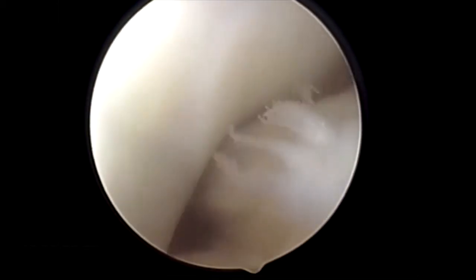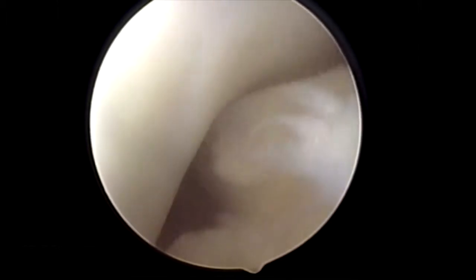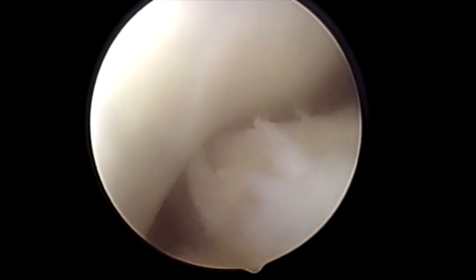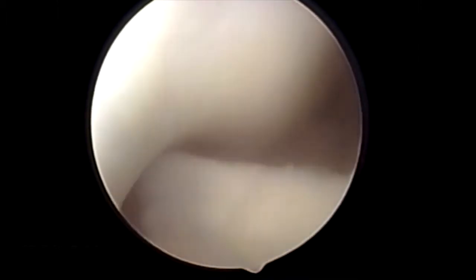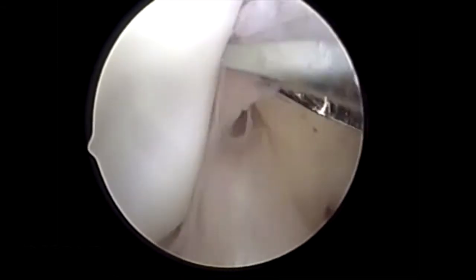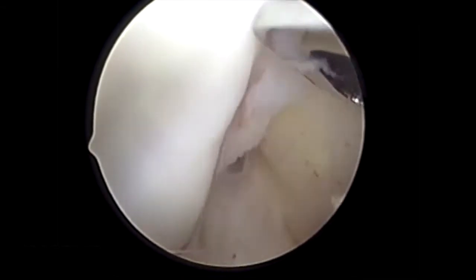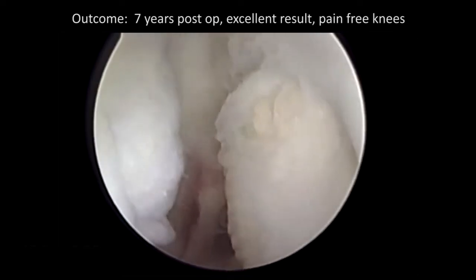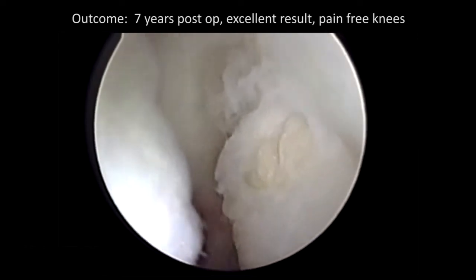Repeated contact is observed at the apex of the notch. Release of the IPP using a punch and resection using a shaver is completed, leaving the fat pad unconstrained, seen from lateral and medial views.